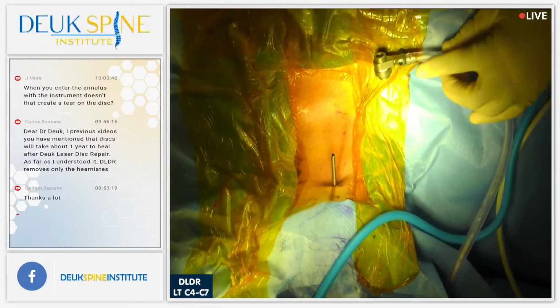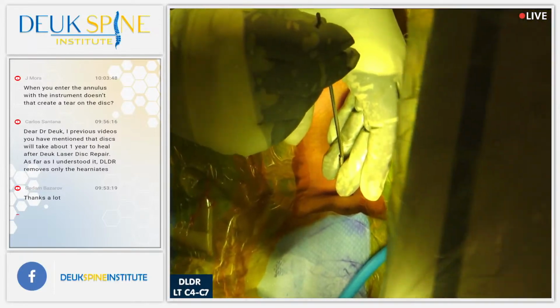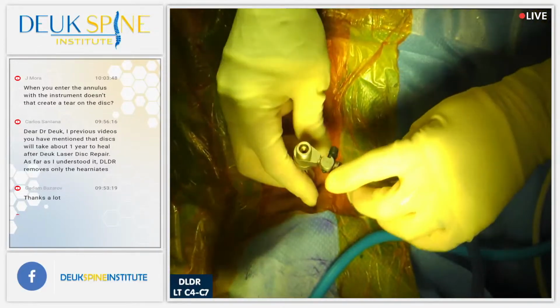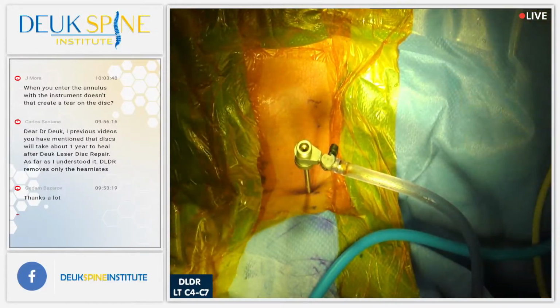Hold on. Make sure these tines are not pushed together too much or apart. Looks good. Hopefully that'll hold. These tubes must be created or purchased. Okay, Luis, that is your top priority.